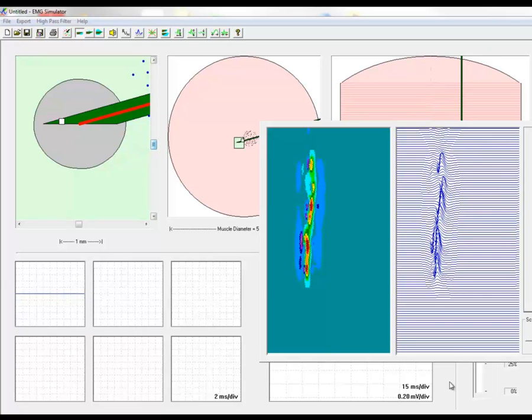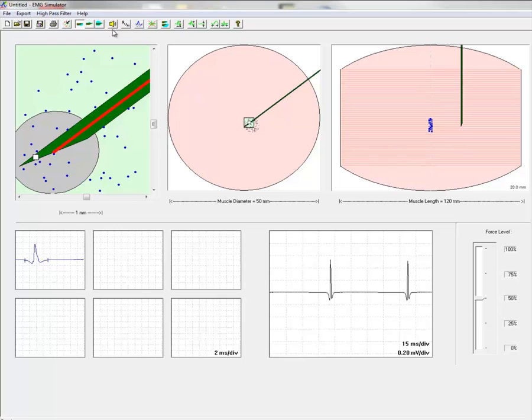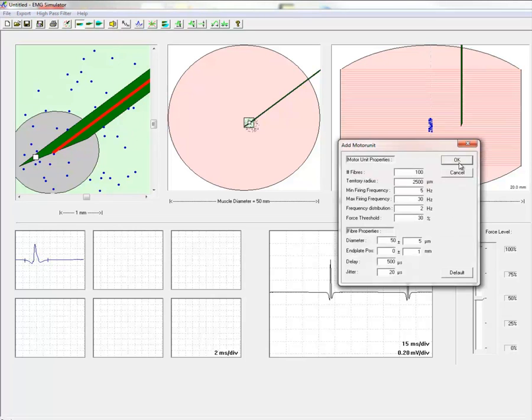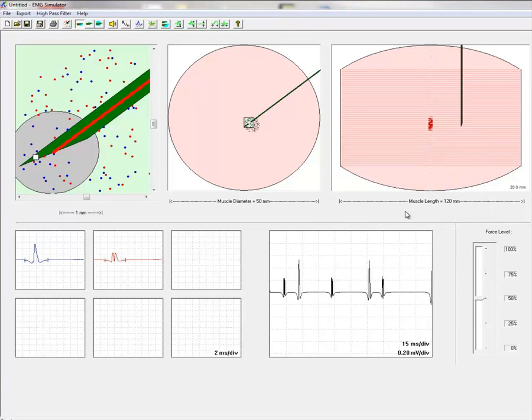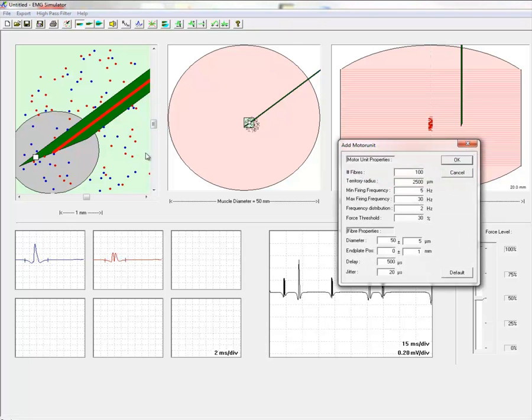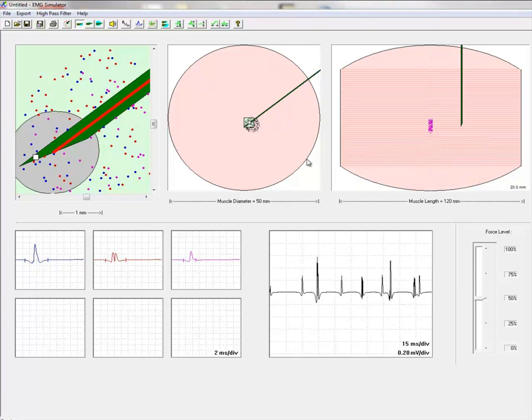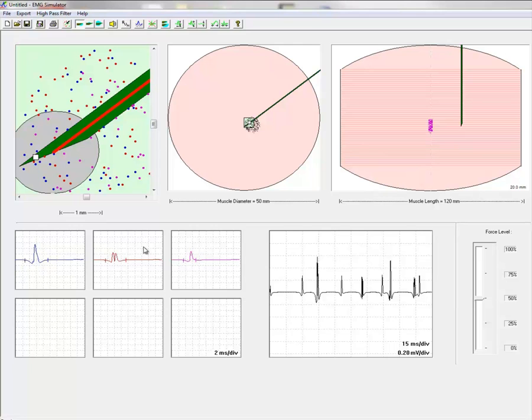When we add two motor units into the recording we will obtain activity from all these three different motor units if they are above firing threshold. They are different in shape but with constant electrode position these motor unit potentials are individually constant.